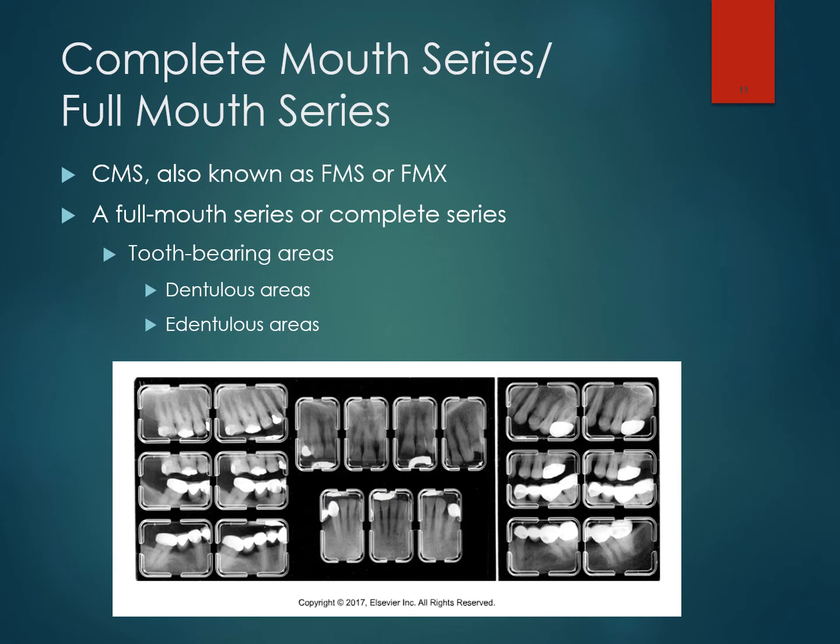Okay, so then this one is our complete mouth series or a full mouth series. I've never seen a CMS used in private practice or anything like that. You might, maybe if you work in one of those weirder offices, but most of the time you're going to see this one right here, FMX, and that means full mouth series, or X just stands for X-rays.